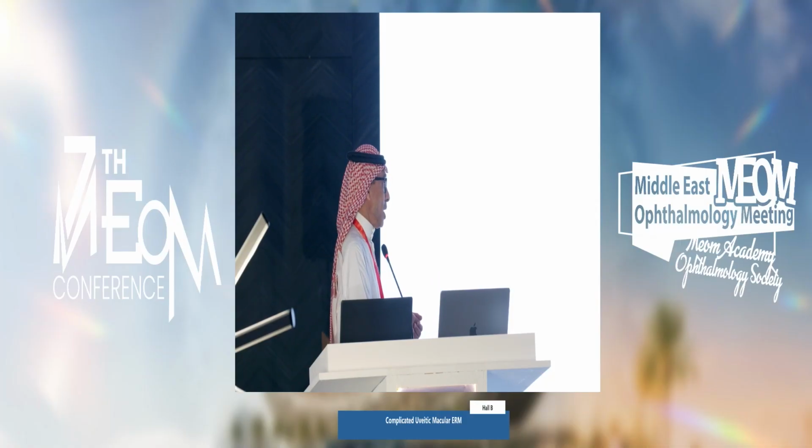So I tended to remove it, and I don't like to get back in the eye. The only thing is to remove this ILM, although it is fragile, as you see, it is really fragmented. But even so, after that, because I would like to give her injections, the Ozurdex or anti-VEGF, to be effective, a stiff ILM would not work well enough.